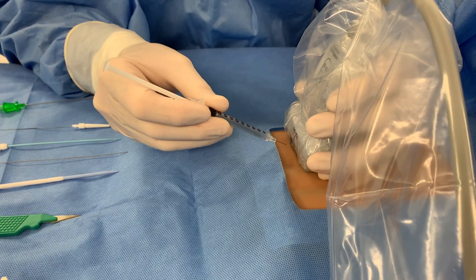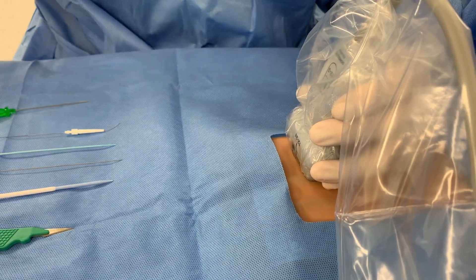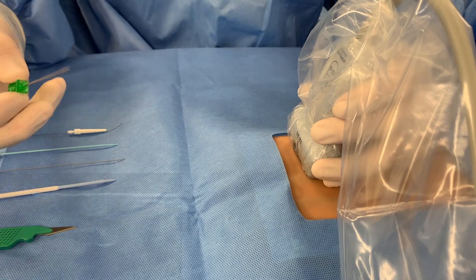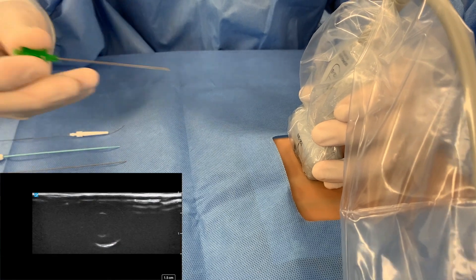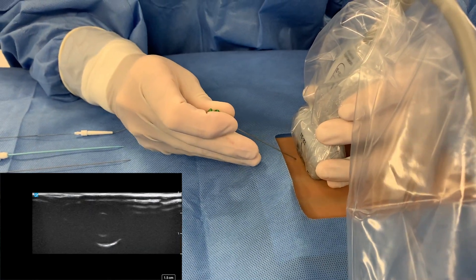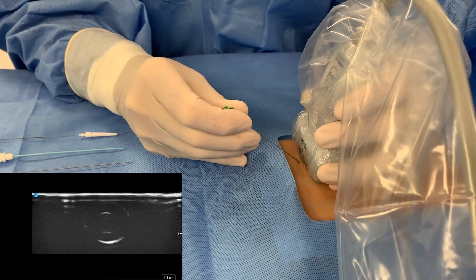Using strict aseptic technique and after applying the tourniquet, infiltrate the skin with local anaesthetic. Under ultrasound guidance, insert the 21 gauge introducer needle.